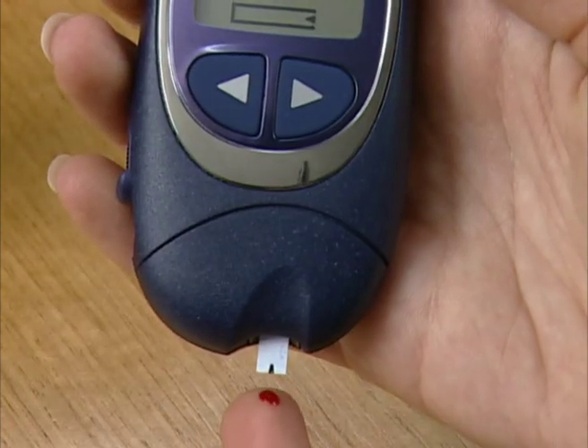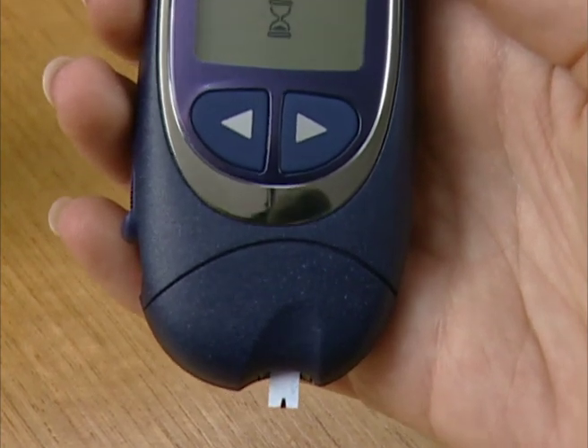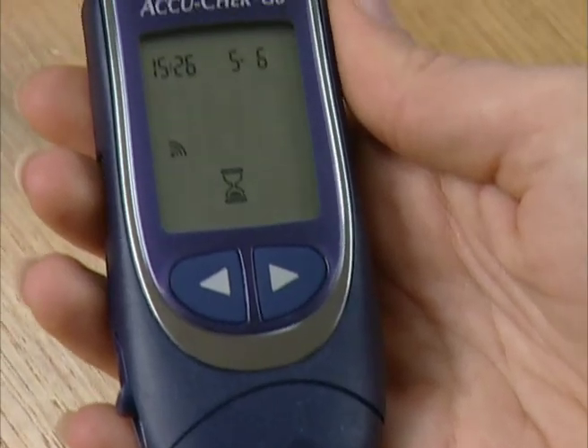Touch and hold the drop of blood to the end of the strip. The blood will be drawn in automatically. If the beep tone is turned on, the meter will beep briefly to acknowledge that enough blood has been applied.